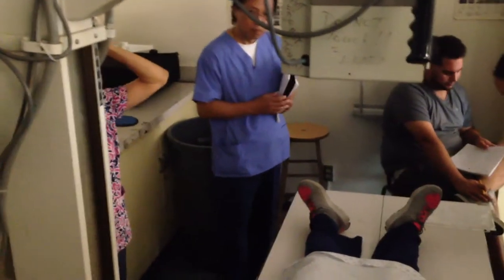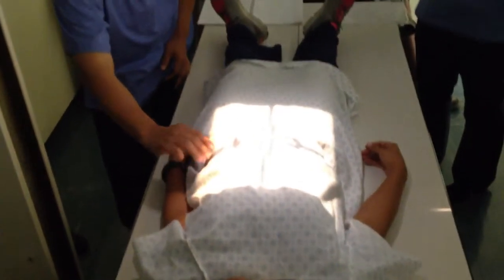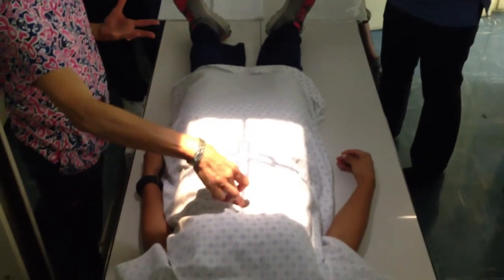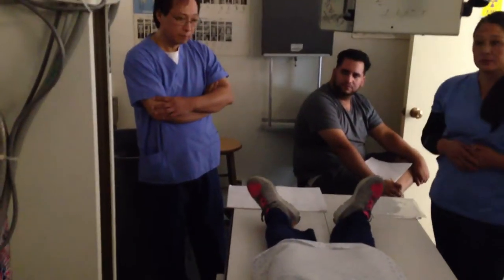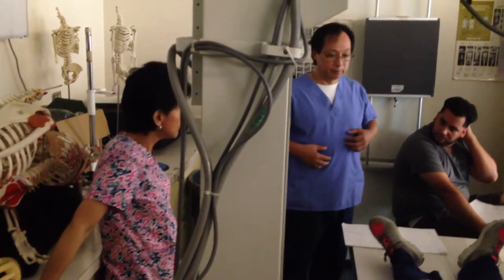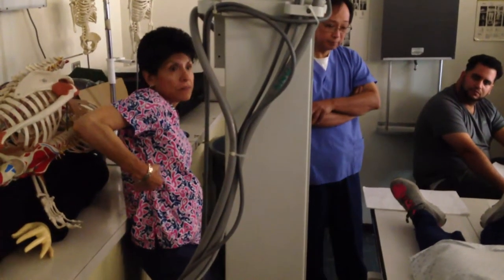It depends on body type. The football players — their stomachs are much higher. Instead of centering three or four fingers above the crest, I would go to the xiphoid process and center there. No — you're going to end up with a chest x-ray. That's why the fundus rule exists. For a bigger patient, you might center at the lower costal margin or even higher because their stomach sits so high. On a smaller patient like her, centering at the xiphoid is grossly too high.